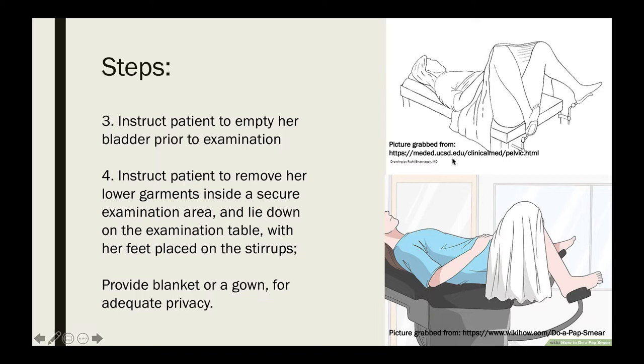The patient should be in a supine position, or you can also elevate the head of the table to 30 degrees, which usually makes the exam more comfortable for the patient.